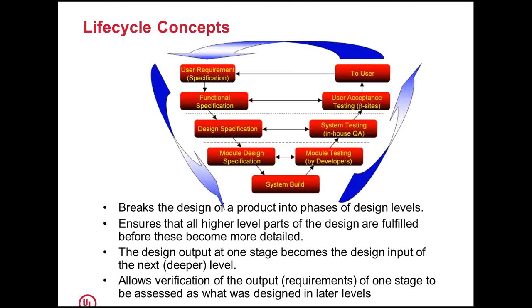This ensures higher level parts of the design are fulfilled before it goes down to the next stage. That means the output of one stage becomes an input to the next stage. This methodology also allows verification of the output requirements of one stage to the next stage before a bug gets transmitted to a later stage.